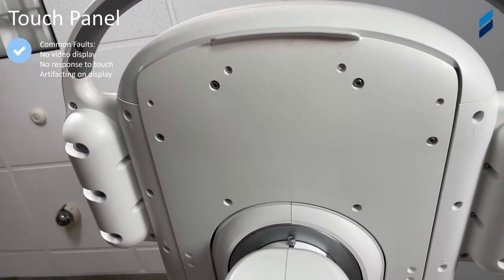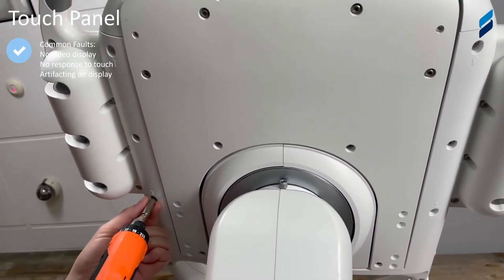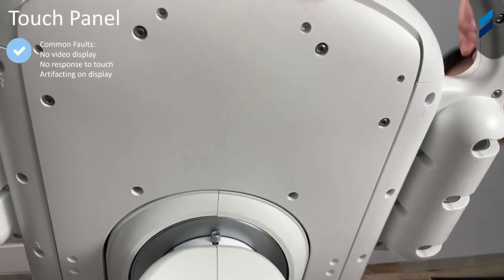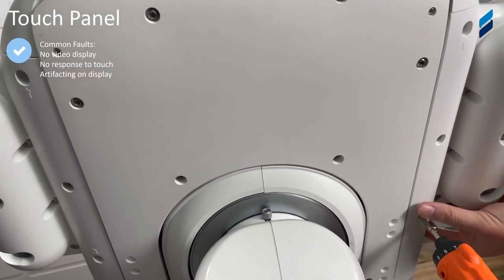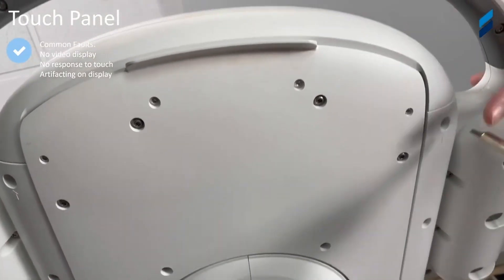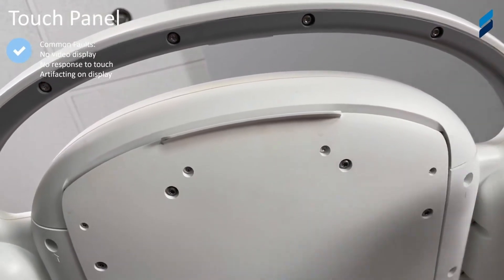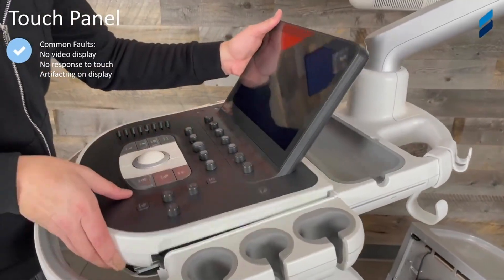Same process here — we're going to go for the perimeter screws. Ignore the other screws because those are for the keyboard; you do not need to remove all of them. We just want to show you what's absolutely necessary to get to the parts you need without removing excessive hardware, because your jobs are already hard enough working on very sophisticated equipment.